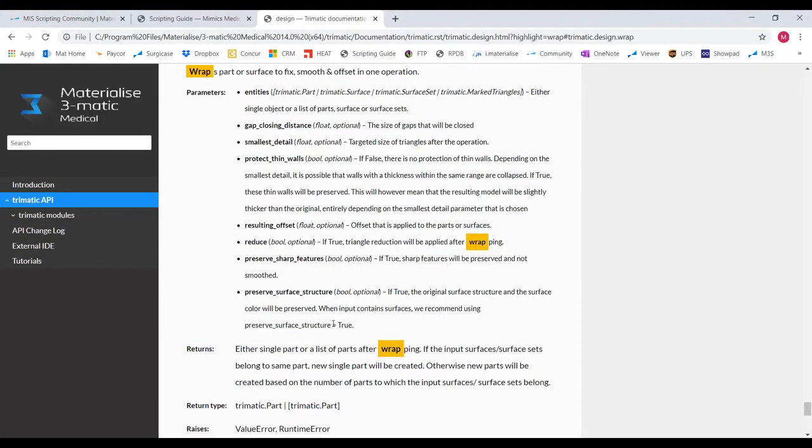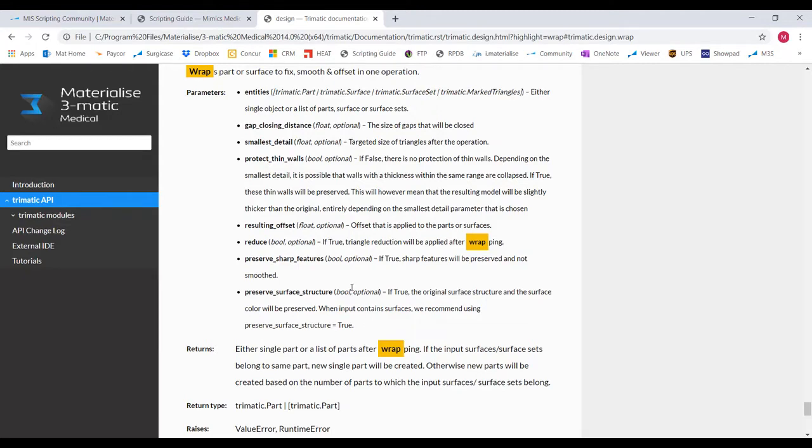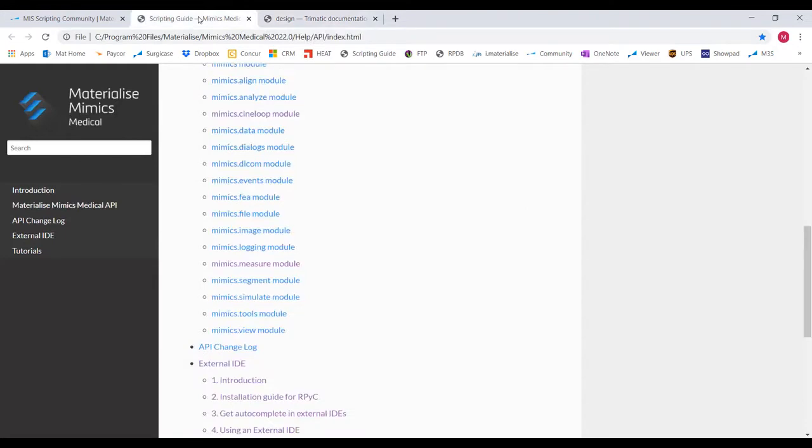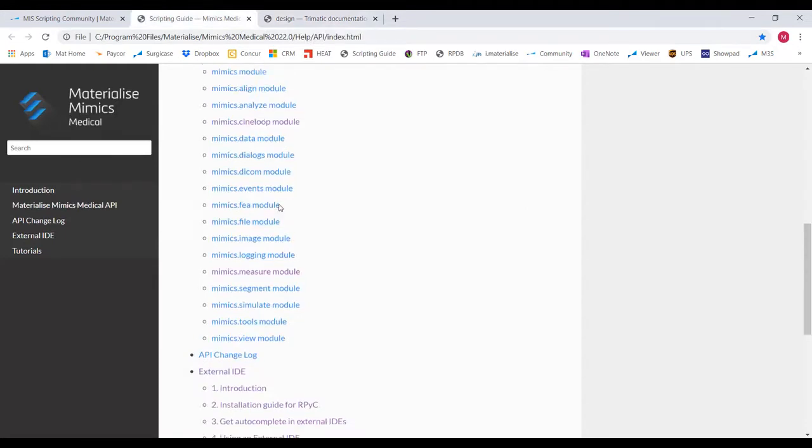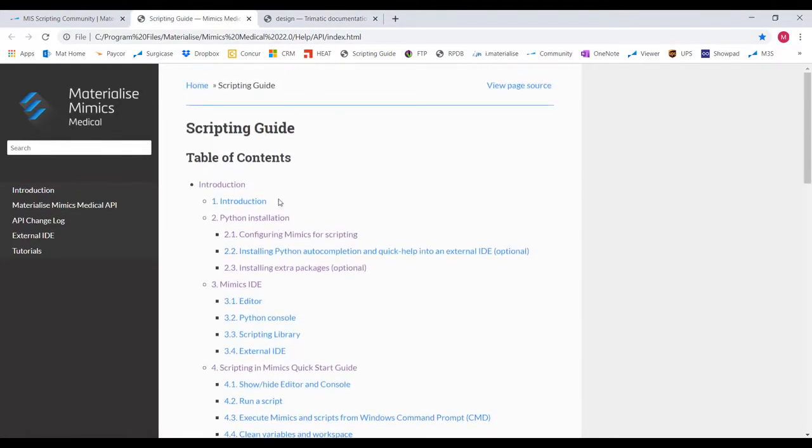This is where your copy-paste skills will really be tested. If you're a copy-paste pro, then guess what? You're a scripting pro in Mimics and 3Matic. Now that you know where to go, let's get you set up with Python and tie it to Mimics and 3Matic.